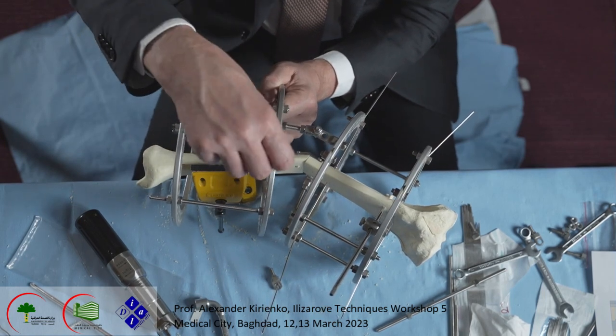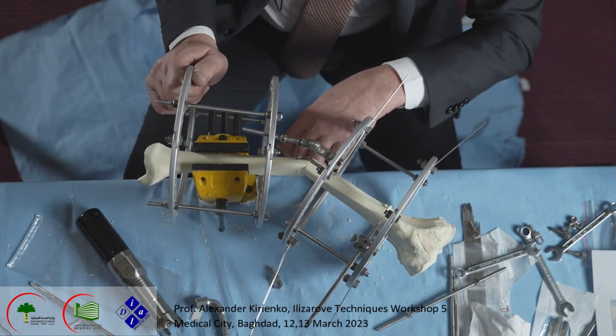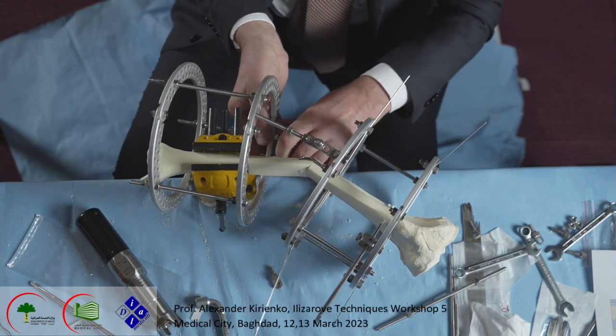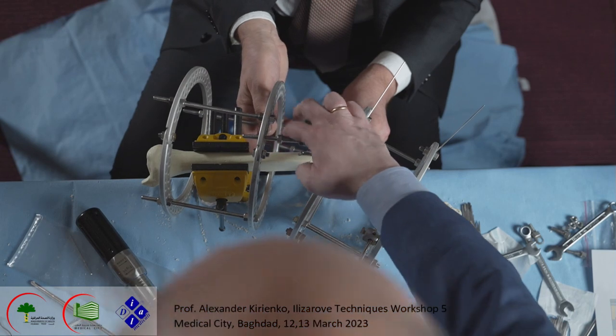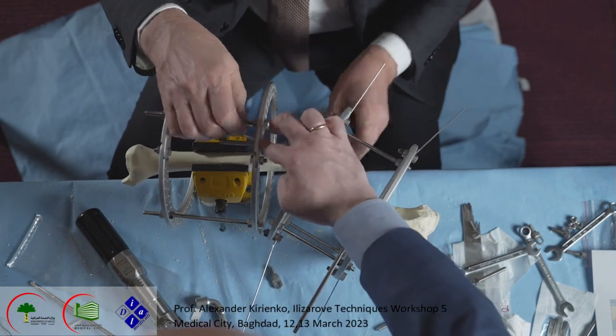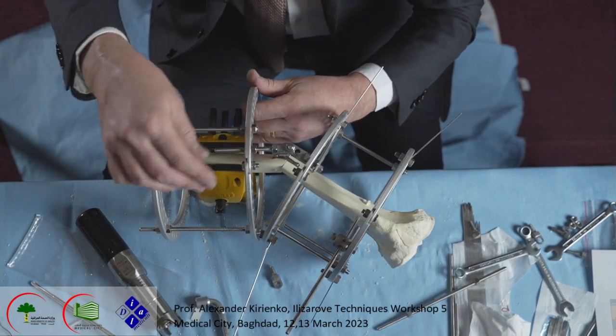Like you see, this is the first hole here and the first hole here, posteriorly, and we should do them at the same length. Distributed plus minus in the way that you keep the proximal and distal part. Good.